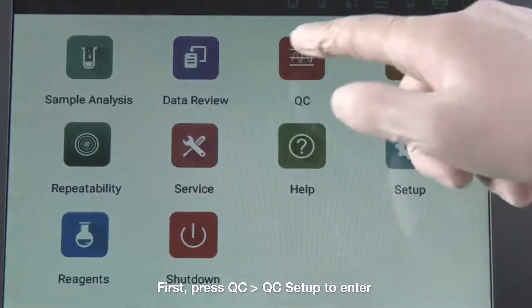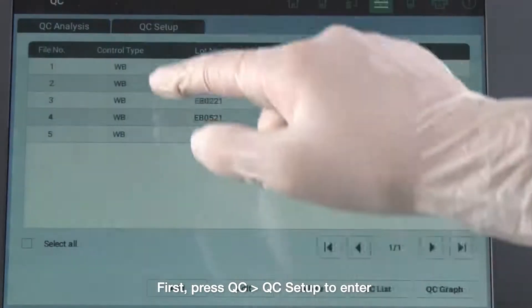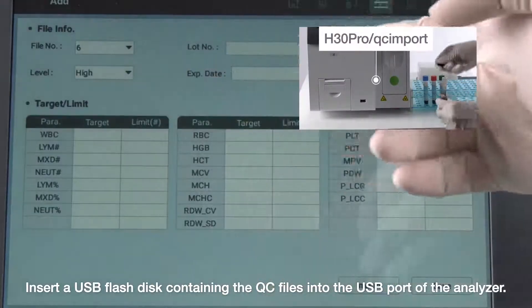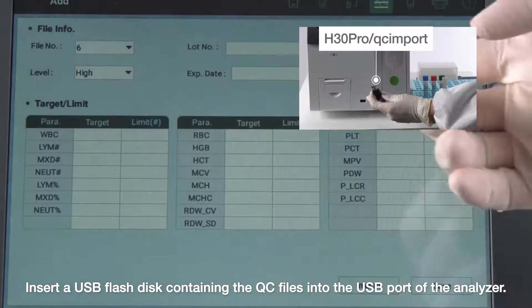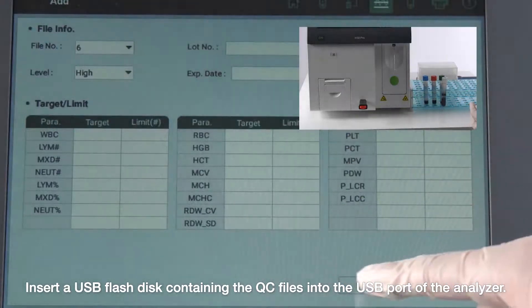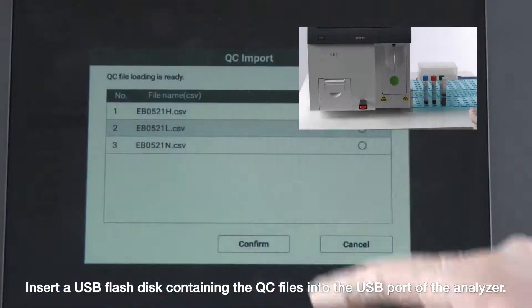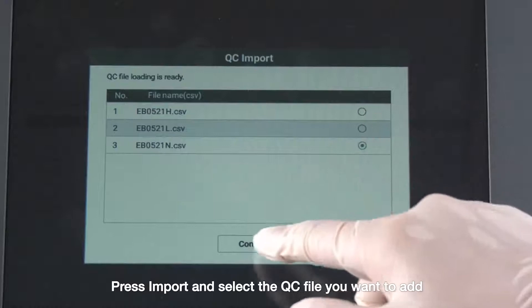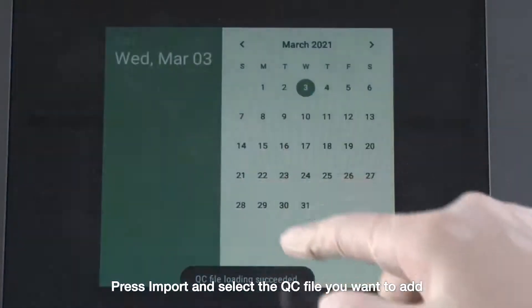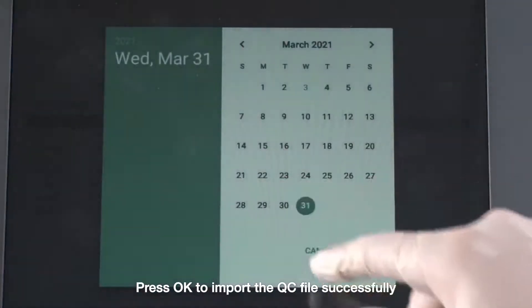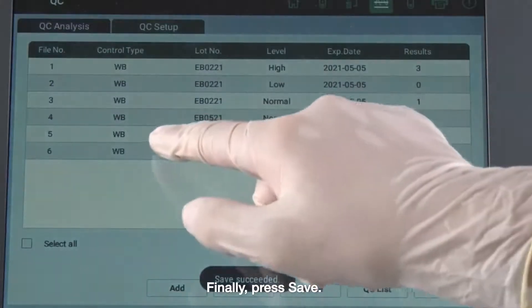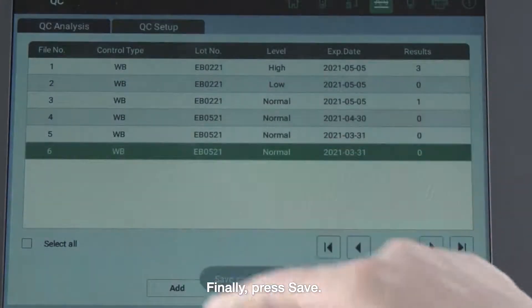First, press Quality Control Setup to enter. Insert a USB flash disk containing the quality control files into the USB port of the analyzer. Press Import and select the quality control file you want to add. Press OK to import the quality control file successfully. Finally, press Save.